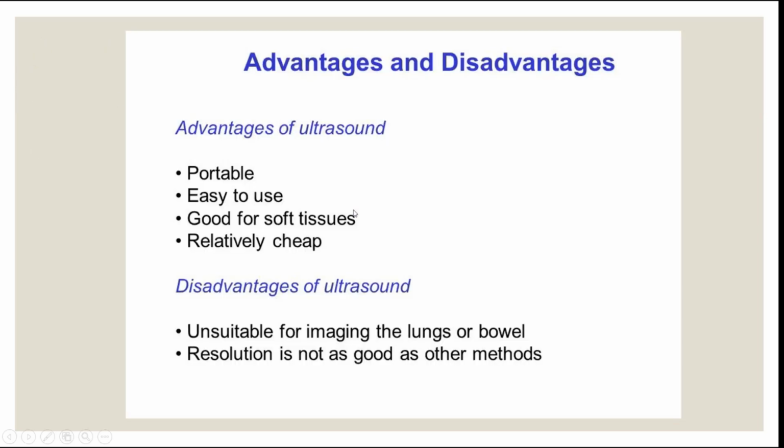Okay, advantages and disadvantages. The advantages are that it's portable, it's easy to use, good for soft tissue, and it's relatively cheap. The disadvantages, it's usually not suitable for lungs and the bowels because of the air. Also, it's not suitable most of the time for any fat structures, obese people, or bones as well. And the resolution is not as good, and it also depends on the person operating the ultrasound because it requires a lot of training.